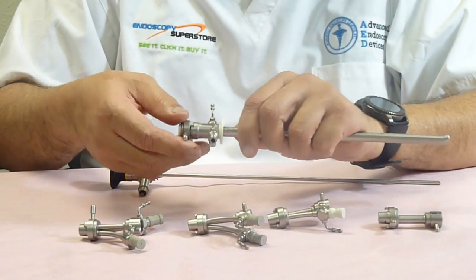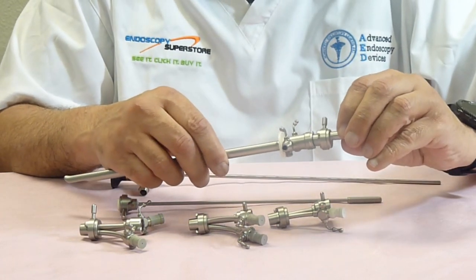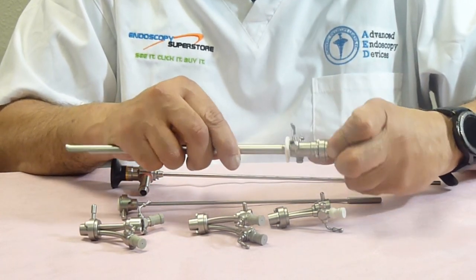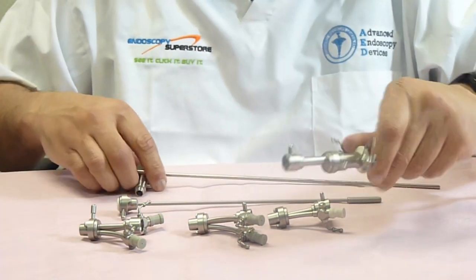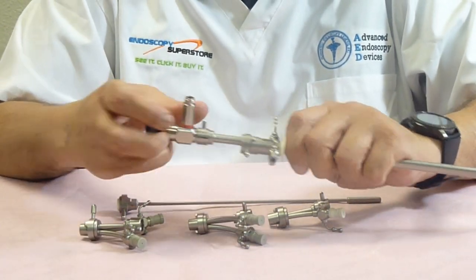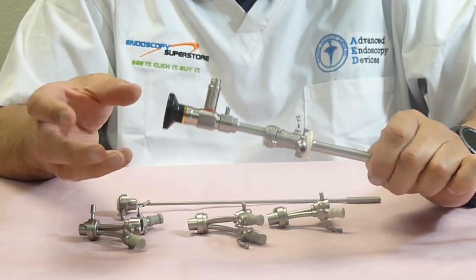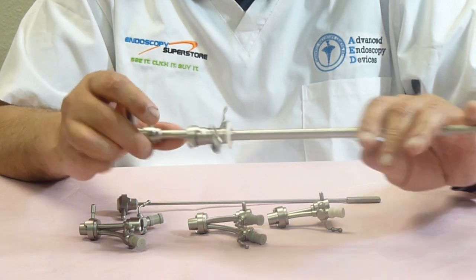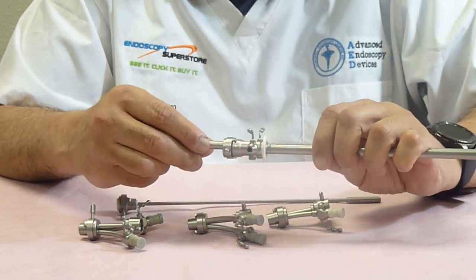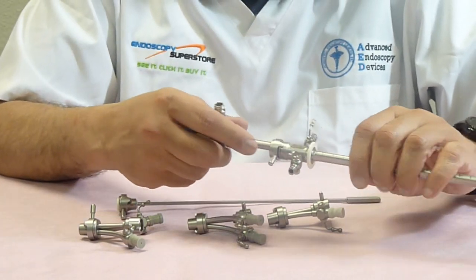Putting the bridge on the sheaths is very simple. You go ahead and remove the obturator, then you lock in the sheath, and then the scope goes right in. Doctors who just want to do an examination of the urethra and the bladder may only want to use a bridge with no channel at all. The advantage is that you can just clamp it in, you have no leakage problem, and you'll be able to put this right into the patient.